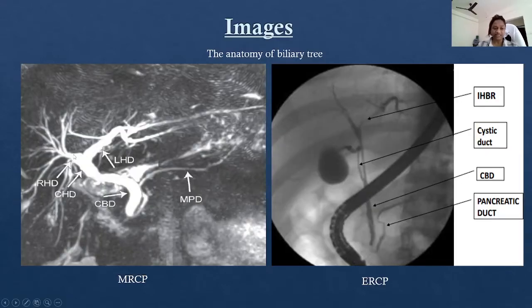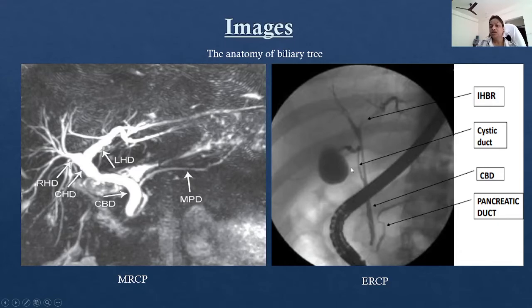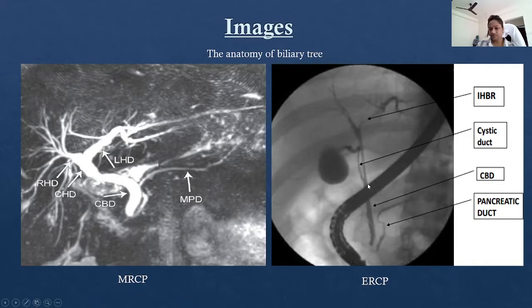Coming to the images: this image shows the normal anatomy of the biliary tree on MRCP, in which we can see the intrahepatic biliary radicals forming the right and left hepatic ducts, which join together to form the common hepatic duct. This common hepatic duct is joined by the cystic duct to form the common bile duct. The thin line is the main pancreatic duct, which joins with the CBD and they both open into the second part of the duodenum. The ERCP image shows the same anatomy — intrahepatic biliary radicals, common hepatic duct, cystic duct, CBD, and the pancreatic duct.